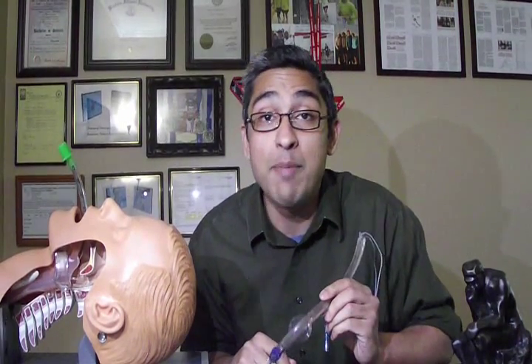Hi, my name is Sangwan. I am an intensivist and I am here to discuss with you a new way of doing percutaneous tracheostomy using a dedicated device.